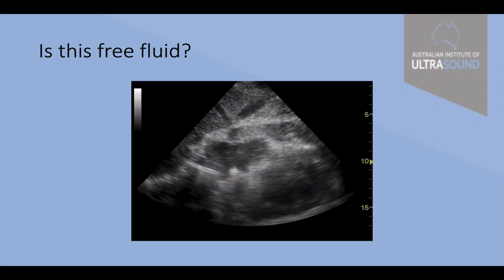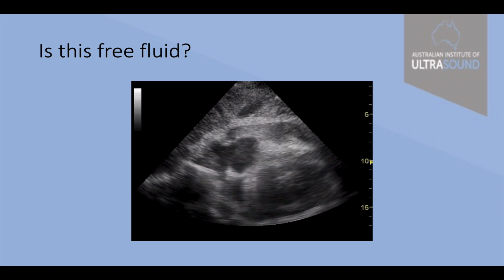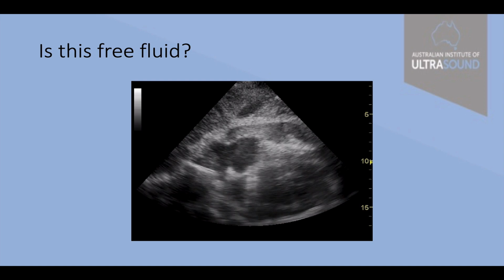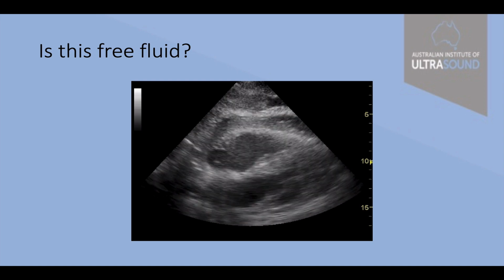No prizes for this one. Hearts are always easy to identify when they're beating. As you can see, this pericardial effusion isn't black, which is very concerning. We're concerned that it's a hemopericardium.